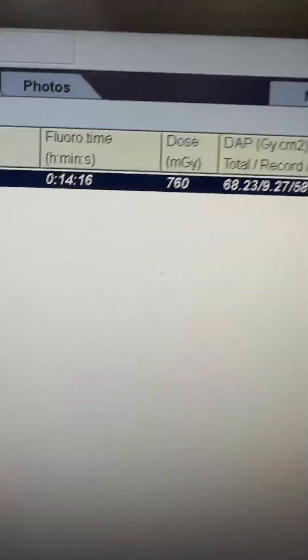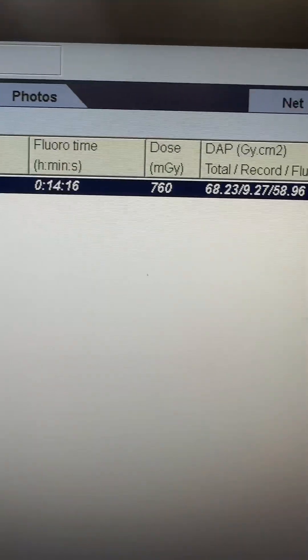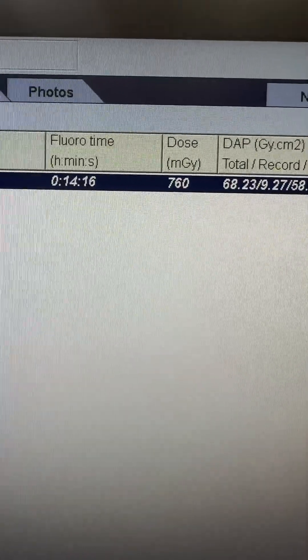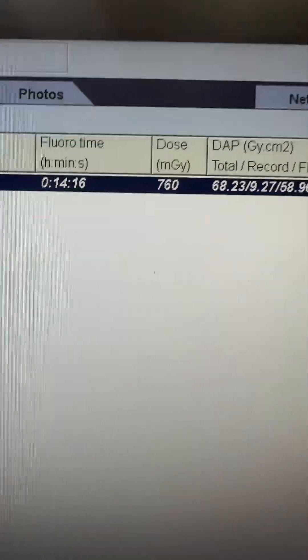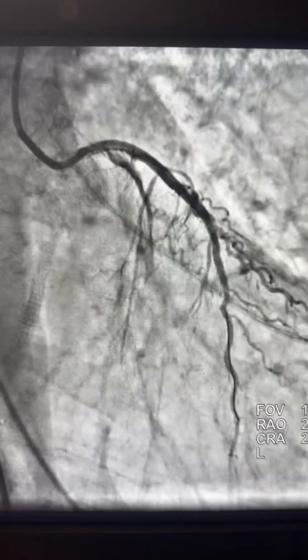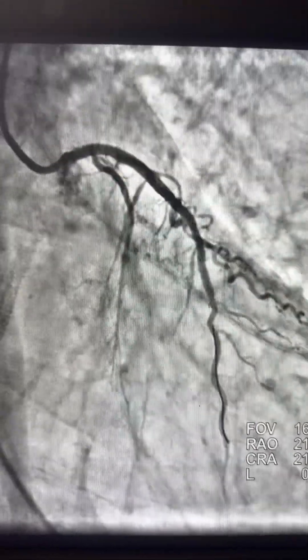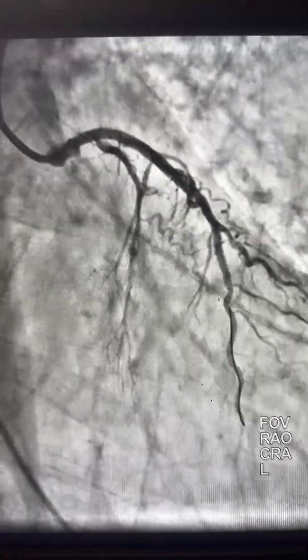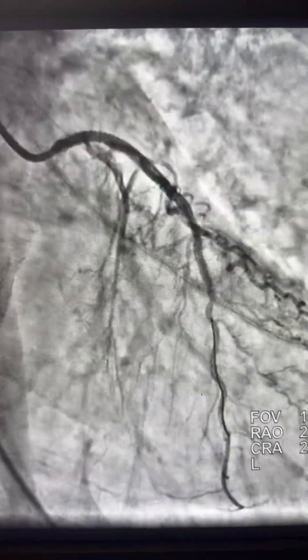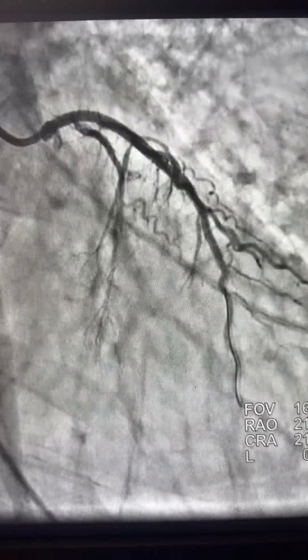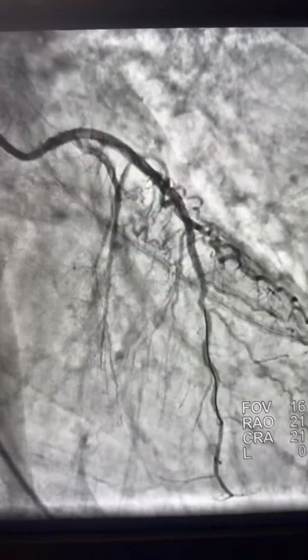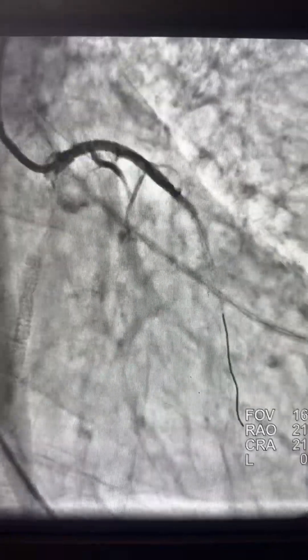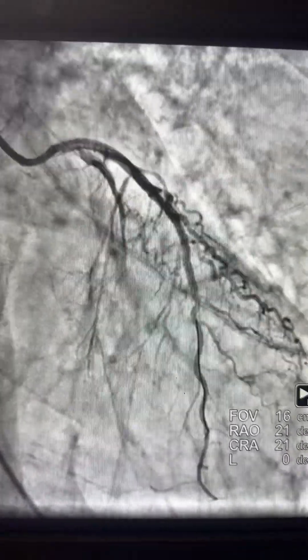And finally, balloon pump placement is performed. The radiation dose and floor time are not bad for such a multi-vessel case. Thank you very much for watching — I just wanted to share this multi-vessel PCI performed during active CPR. I hope you enjoyed it.